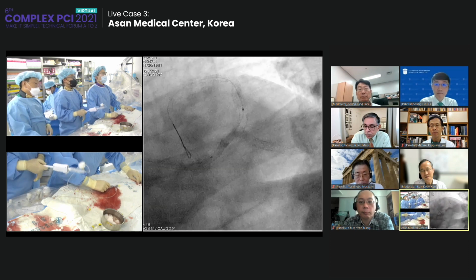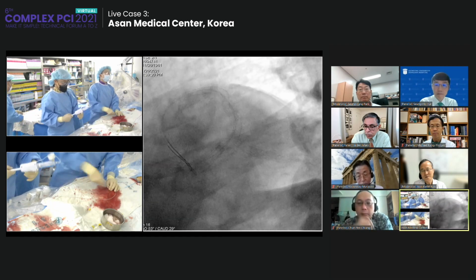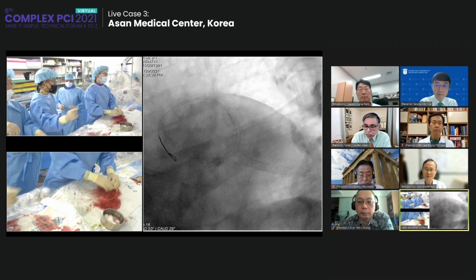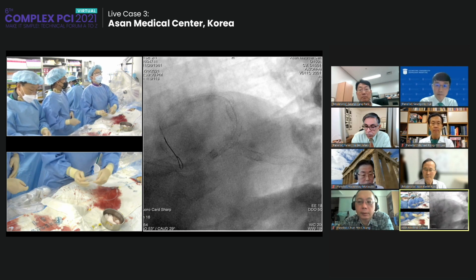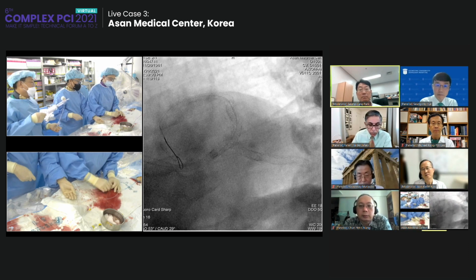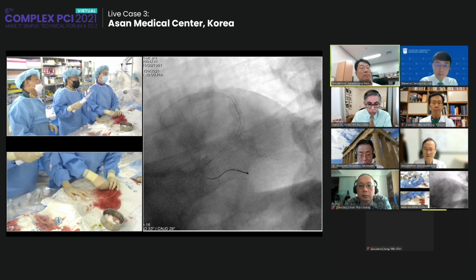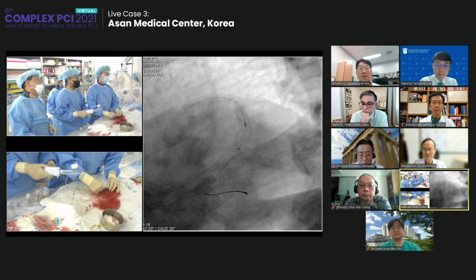3.5 NC, please. So I think this is the value of imaging and physiology guided PCI, like this case of unexplained recurrent chest pain. If this patient had a thallium scan or treadmill, there would be some depression or perfusion defect. During the procedure, I recommend aggressive physiology assessment. Also, imaging guided optimization would be essential in some very difficult decision making patients.